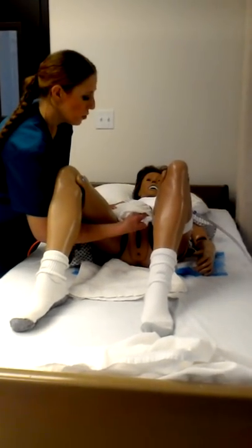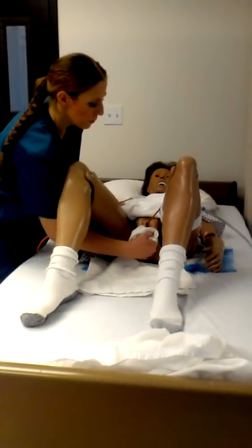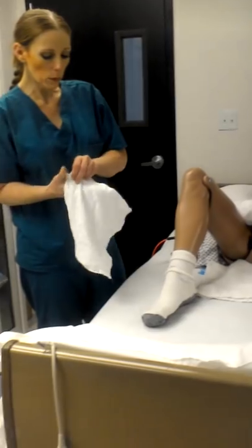You go down the tubing about three to four inches. Pinky. Turn it around.